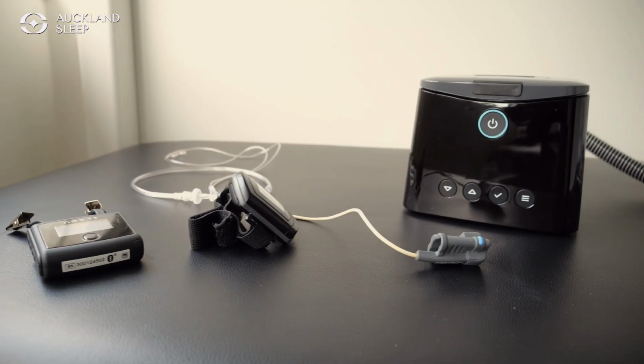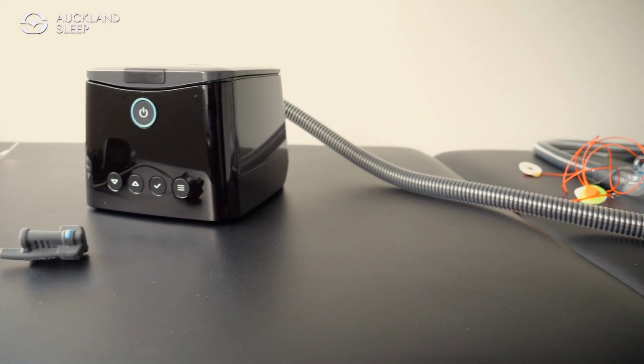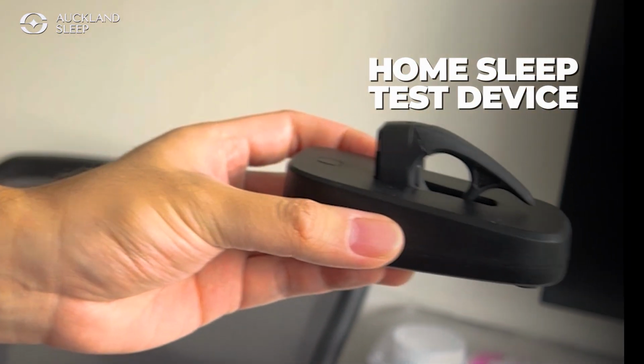Yeah, I think a lot of patients think that doing a sleep study is a huge, uncomfortable thing with heaps of wires going all over the body. And while that is true, that's only one of the levels of sleep study that we do. One of the devices that we use is for a home sleep test.